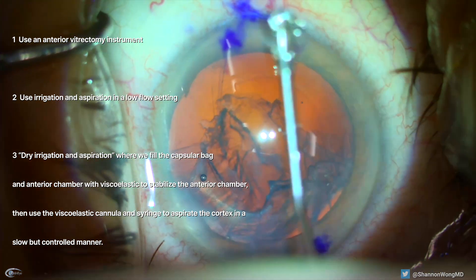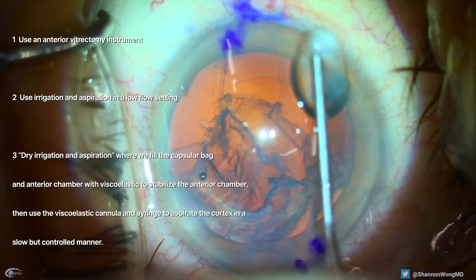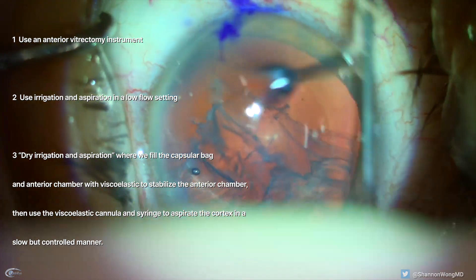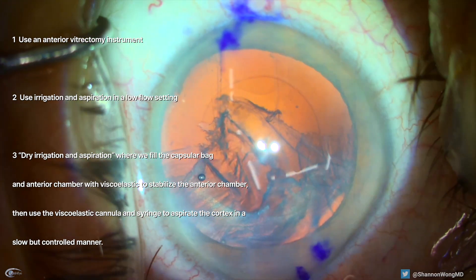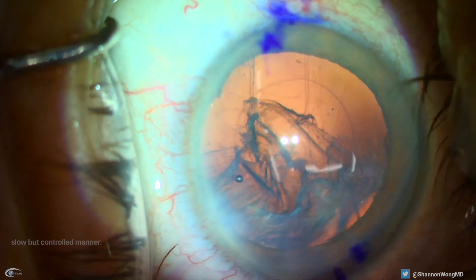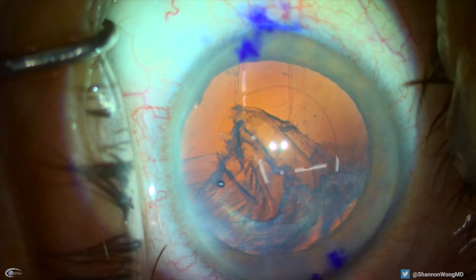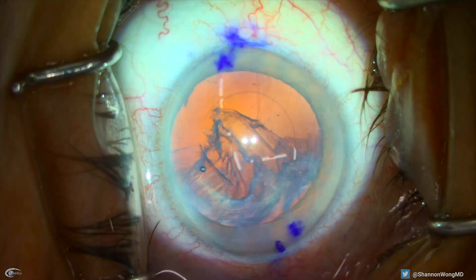We choose dry irrigation and aspiration — our ultimate choice — where we fill the capsular bag and anterior chamber with viscoelastic to stabilize the anterior chamber, then use the viscoelastic cannula and syringe to aspirate the cortex in a slow but controlled manner.